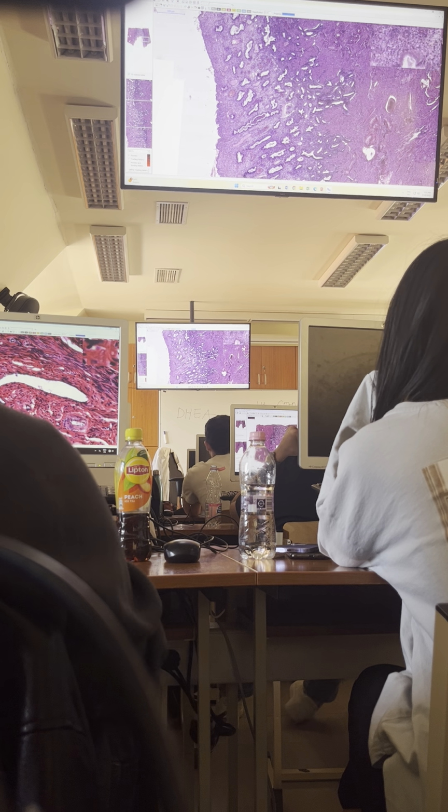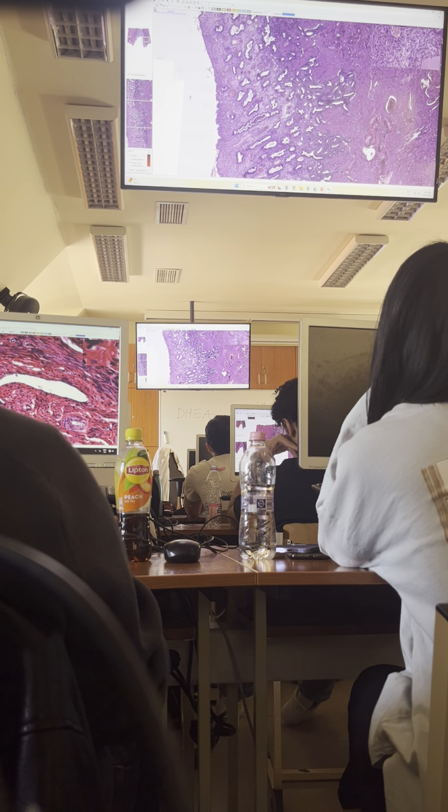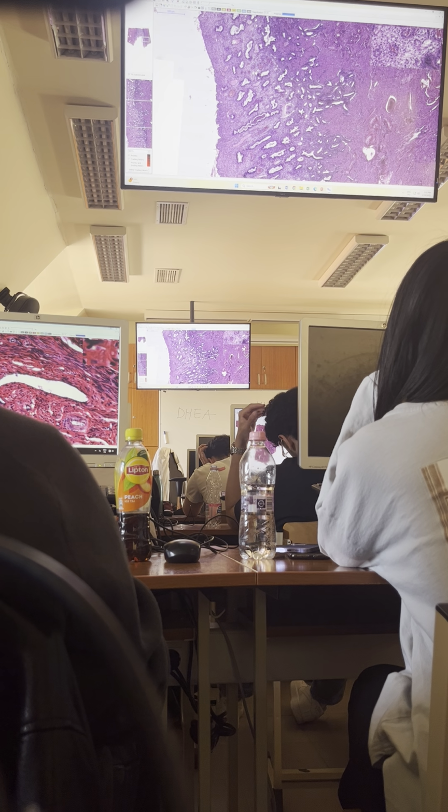Okay. So remember, in the first half, we couldn't differentiate the functional layer into compact and spongy layers. It is possible only in the secretory phase.